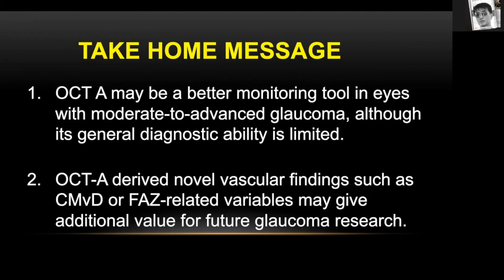Take-home message. OCT-A may be a better monitoring tool in eyes with moderate to advanced glaucoma, although its general diagnostic ability is limited. And OCT-A specific novel vascular findings such as CMVD or FAZ-related changes may be of help for future glaucoma research.